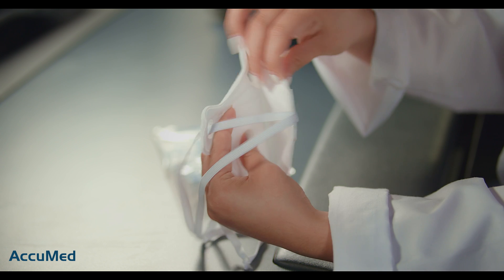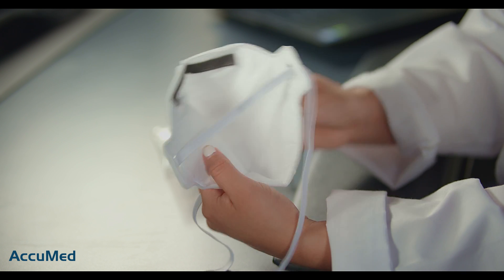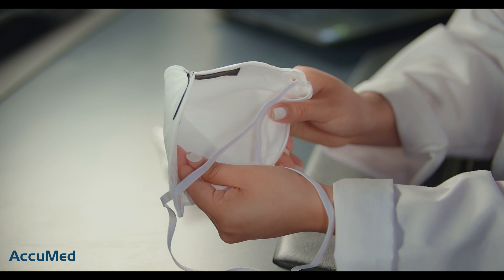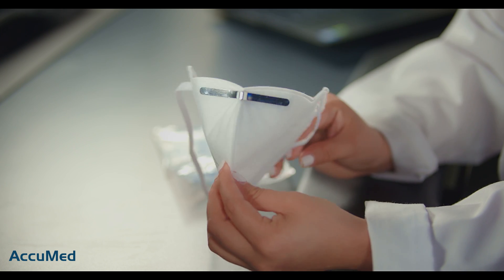This is how it looks from the inside. It does have a very thin nose foam — it's actually very soft to the touch, and the respirator itself is pretty soft as well. The nose wire is actually outside of the mask, which personally is not my favorite.